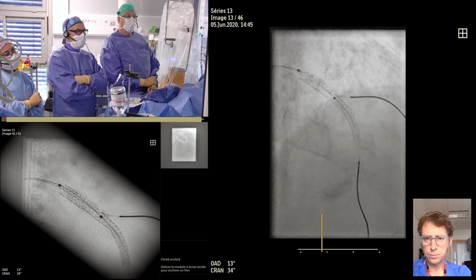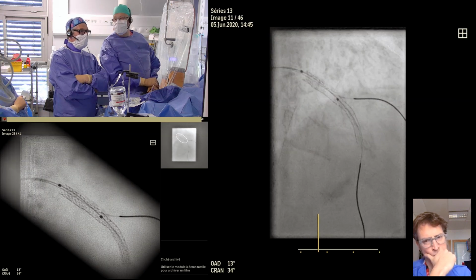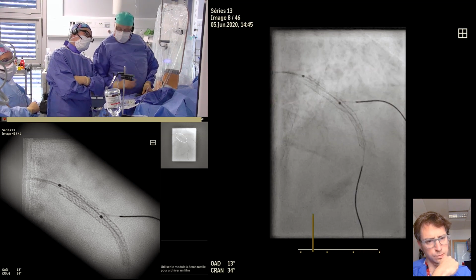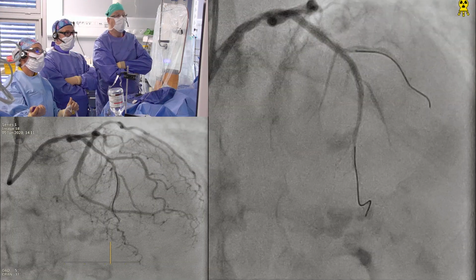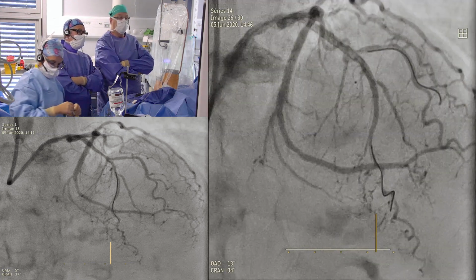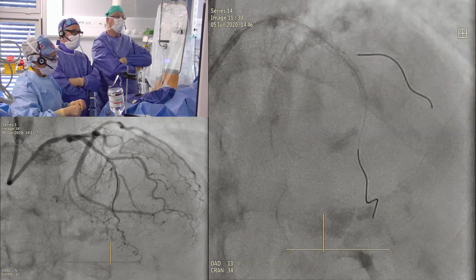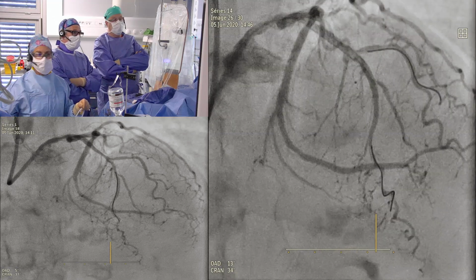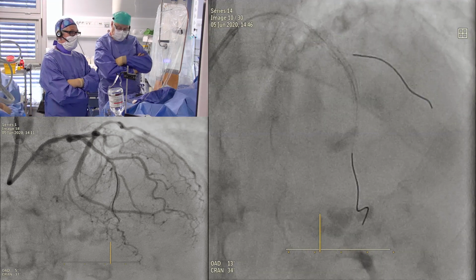It's nice. This version of stent boost is interesting because usually we are confused by the radio-opaque part of the wire, but here it's well visualized. Nice expansion of the stent into the bifurcation. So the result on the ostium of the diagonal is still the same. No modification. So I think it's very nice. I'm convinced that many people will stop at this level, but because the diagonal is big, we think that it's better to open the strut toward this diagonal.